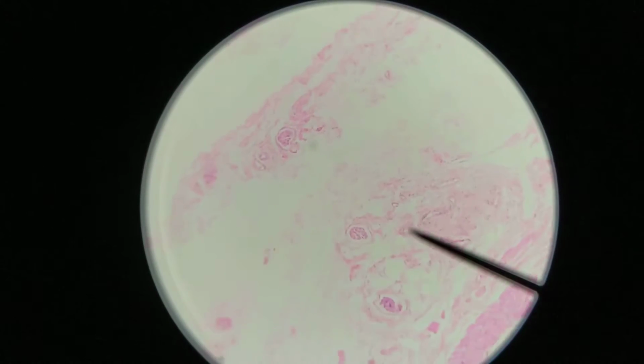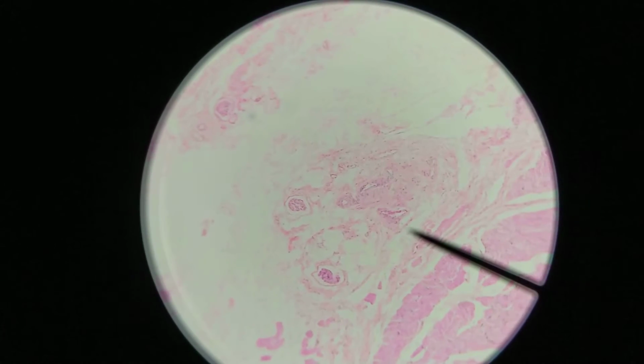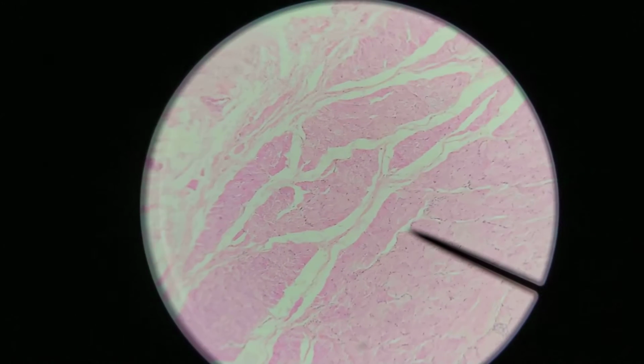Okay, so we're actually looking at the upper portion of the esophagus, and so again we know this because we're looking at tunica adventitia out in the outer region, but we also know that this is the upper portion of the esophagus because, hopefully we can tell, that the muscle here is actually not smooth muscle but skeletal muscle, or rather striated muscle. Okay, so what we're seeing here is striated muscle in cross section, and we see that in the upper portions of the esophagus where you still have the ability to swallow, and so a bit more control over this muscle.